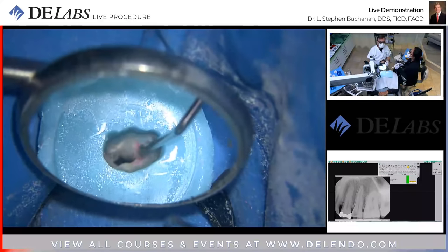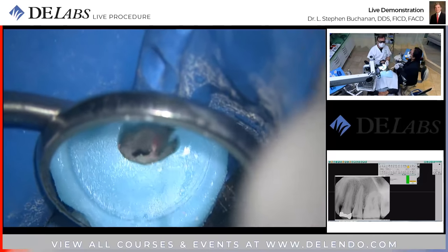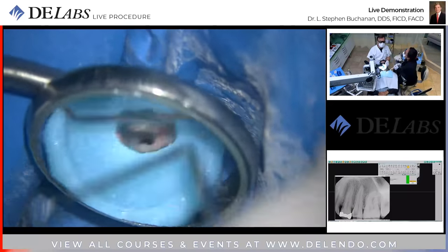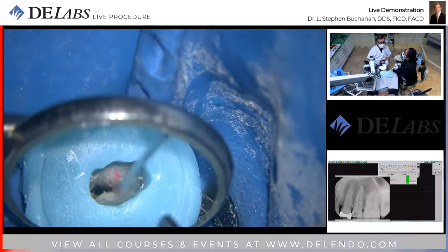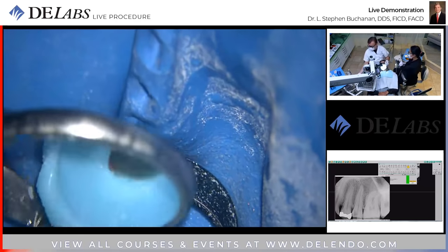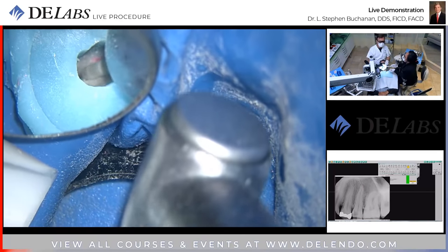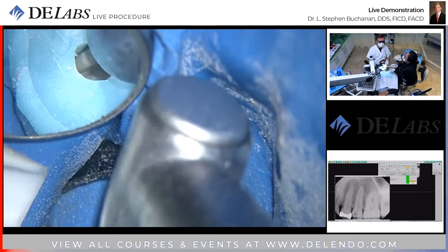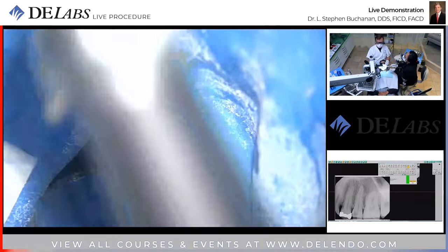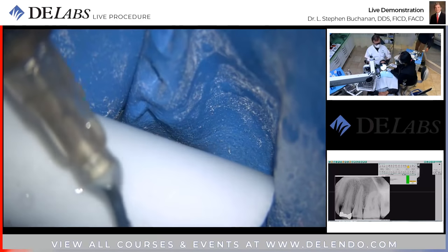Last little piece of gutta percha out of there. I should have just done as she said and taken it out before we put this on. I guess that's just a little bit of pink smear. So let's do some gentle waving. Actually, I want to taper that orifice a bit. Remember, this is sound energy, and it doesn't move around sharp contours as well as smooth contours.